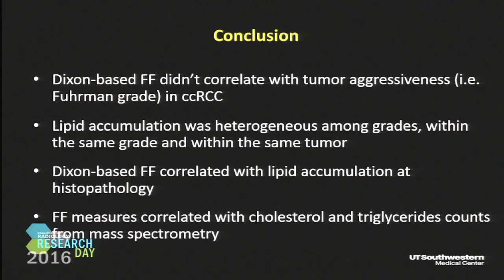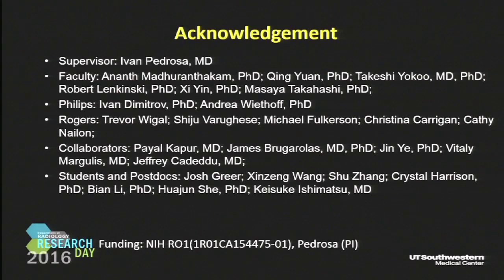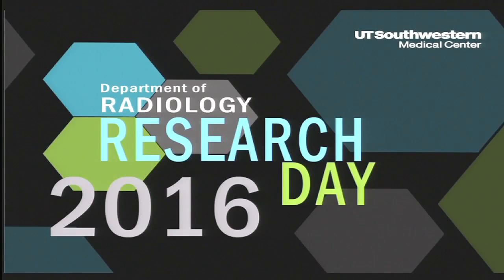We also validate our results by confirming that the in vivo Dixon-based fat fraction correlates with lipid accumulation indicated by Oil Red O staining, and also find a correlation with lipidomic results from the mass spectrometry. Thank you.